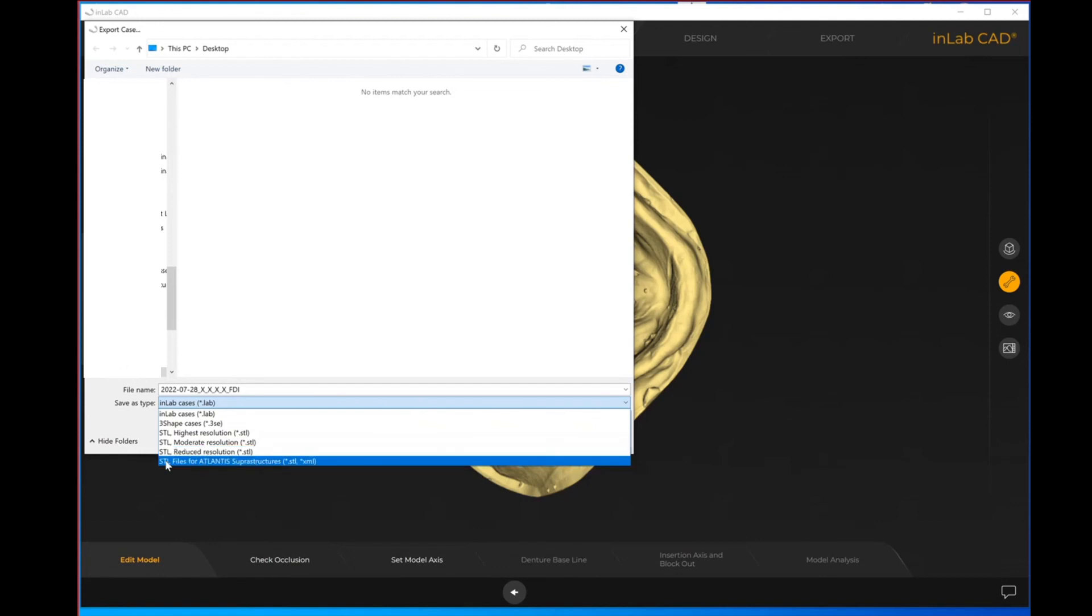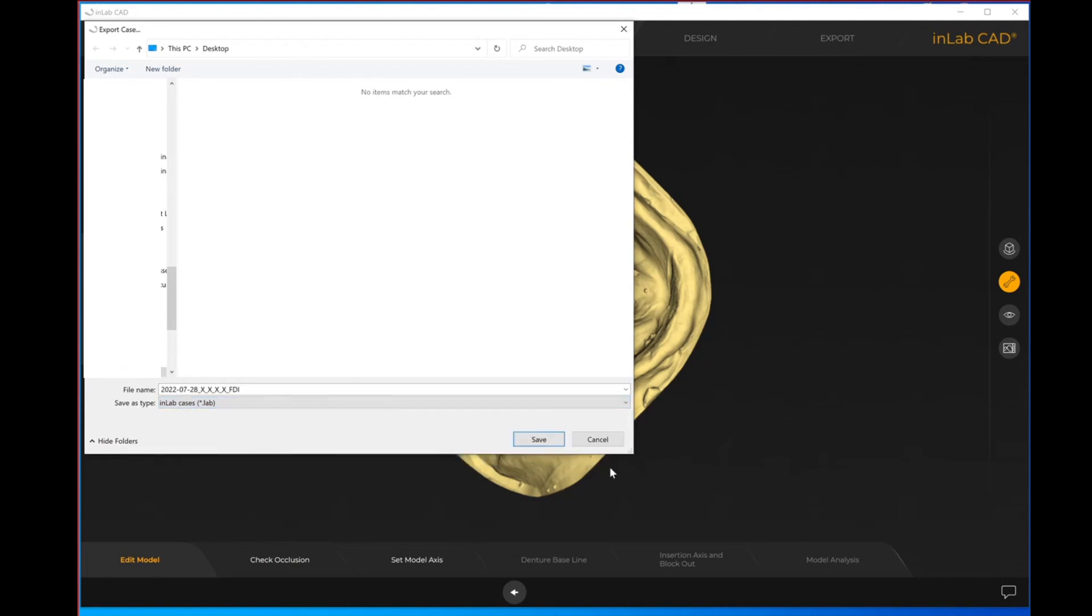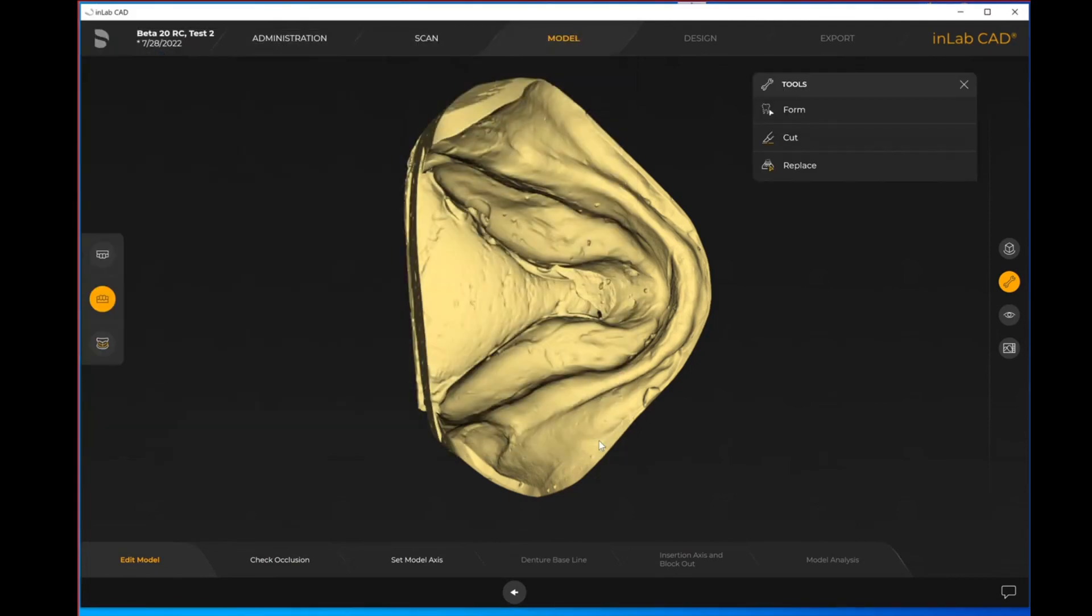Reducing and moderate makes the file a little bit smaller, so a little bit less clear in terms of its resolution. Then you also do have the ability to export as STLs for Atlantis superstructures as well.